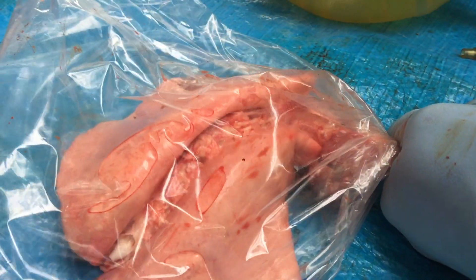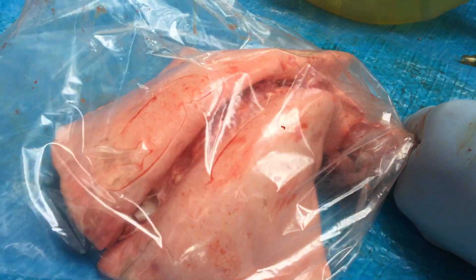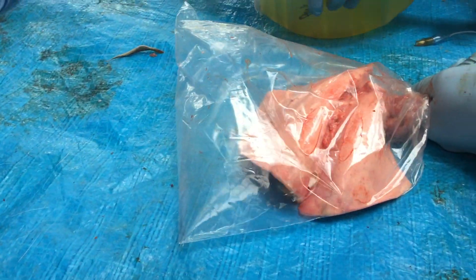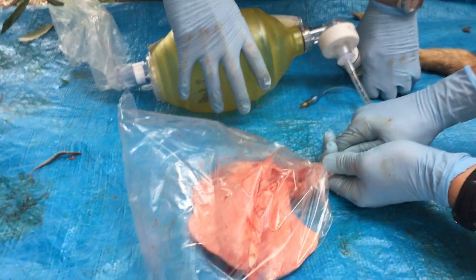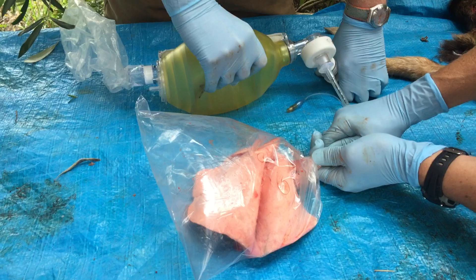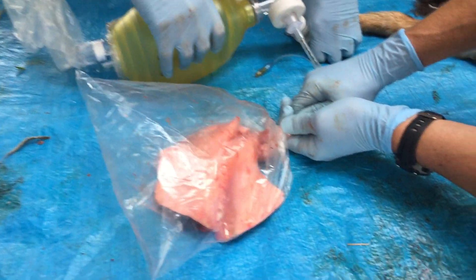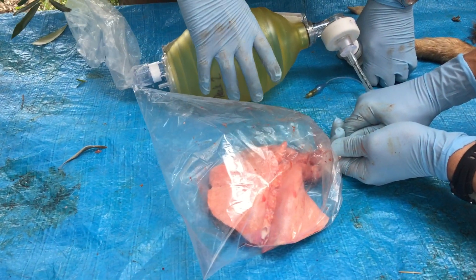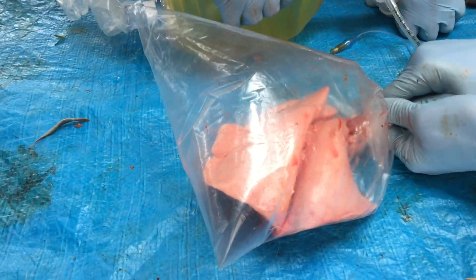I'm bagging a bit faster than we normally would. But as you can see, the air is escaping from the lungs and into the pleura. Little by little the bag is getting filled more and more. Currently there's no pressure against the lungs that I'm feeling — it's just as easy as it has been.